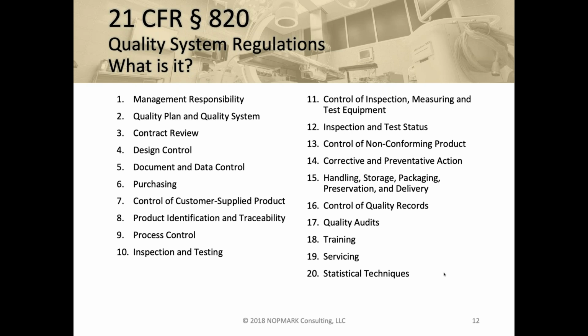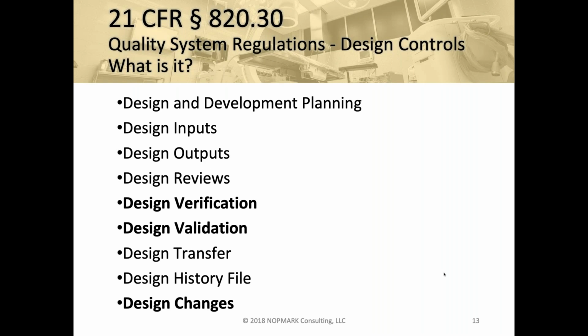And the term you will hear frequently is it's validated for its intended use. So if I'm using software, for example, to track bugs or defects, how do I know that bug tracking system, for example, Jira, does what it's supposed to do? So that level of testing of the tools and the software you use is also something that's covered under these regulations. But let's look at number 4 in more detail, which is the software that's used in your primary product, your medical device software itself.